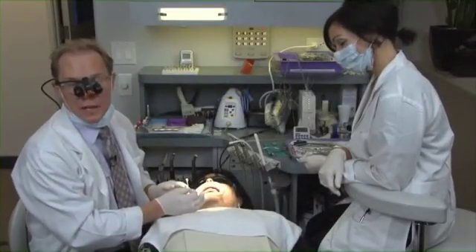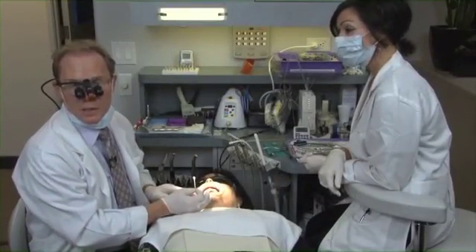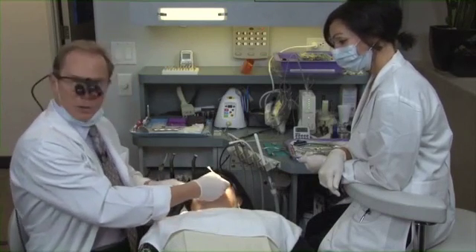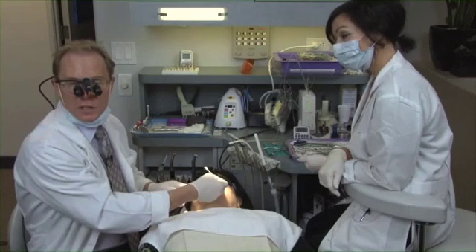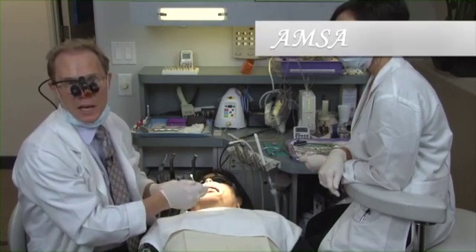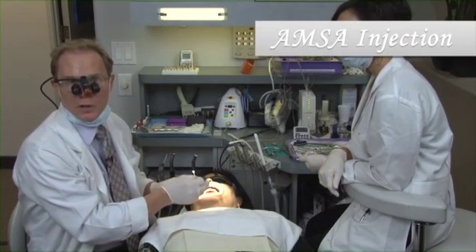Since the preparations were into dentin, we are going to anesthetize Elizabeth. Typically on these cementation days, rather than numbing up her whole upper lip with multiple injections, I like to give a palatal injection called an AMSA — Anterior Middle Superior Alveolar.